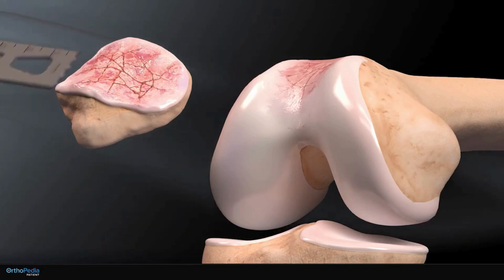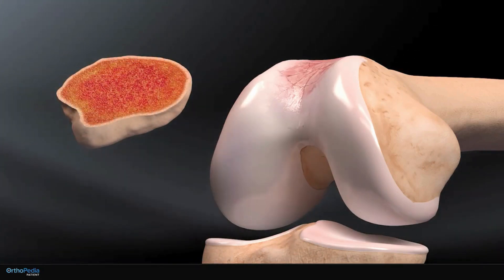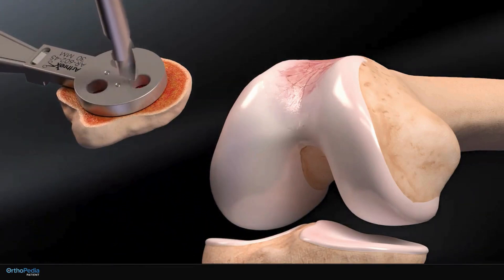The cartilage and damaged bone on the underside of the kneecap are first shaved down. Three holes are then drilled into the exposed surface of the kneecap to prepare the bone for a plastic implant.